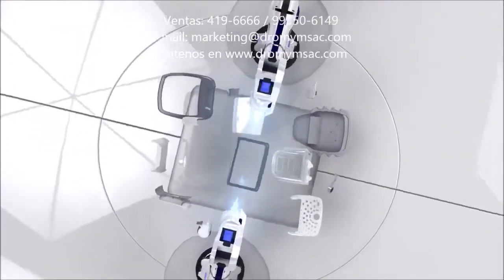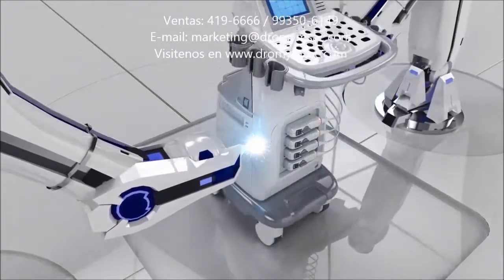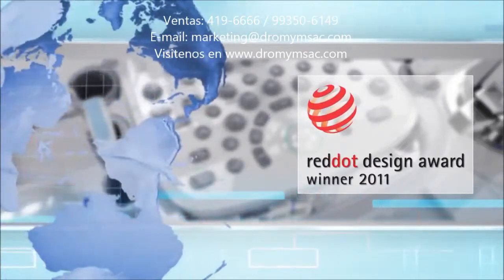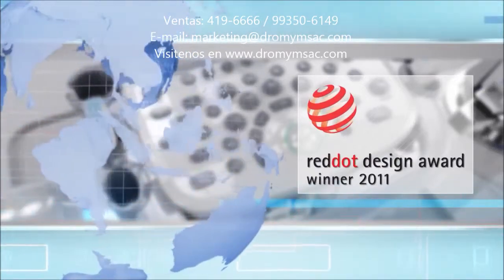S20, excellent ergonomic design, smooth and beautiful outline. S20, winner of the 2011 Red Dot Award. The Red Dot Design Award has a 50-year history. It's a top honor, the Oscar Award of Industrial Design Fields.